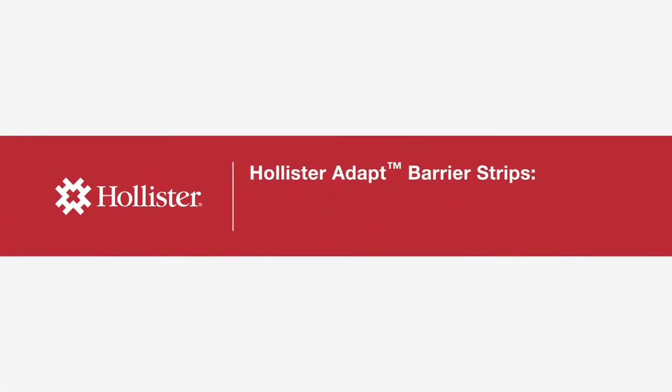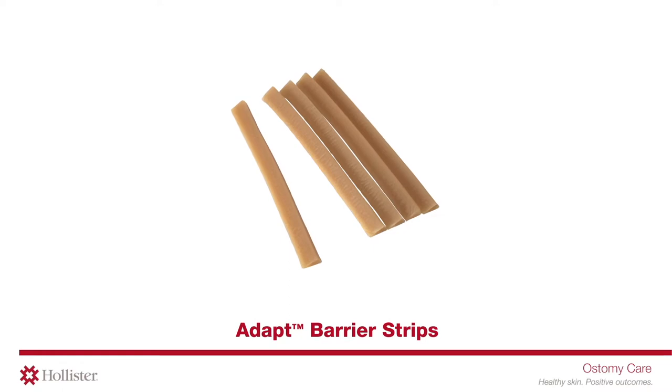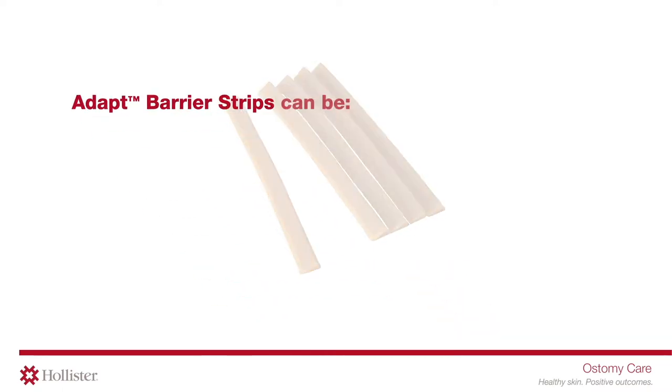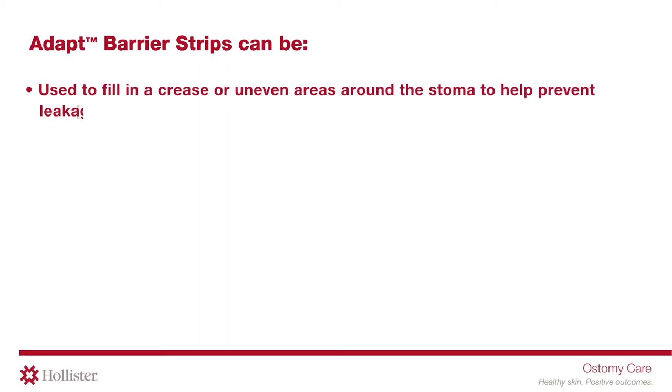Hollister Adapt Barrier Strips: managing stoma leakage and abdominal contours. Adapt Barrier Strips can be used to fill in a crease or uneven areas around the stoma to help prevent leakage. Strips can be cut to various lengths for an exact fit.